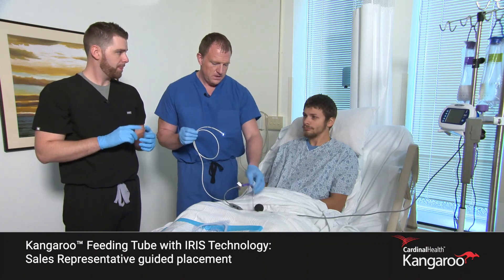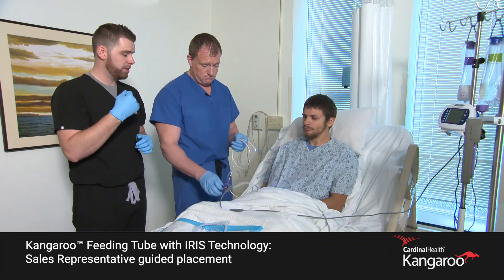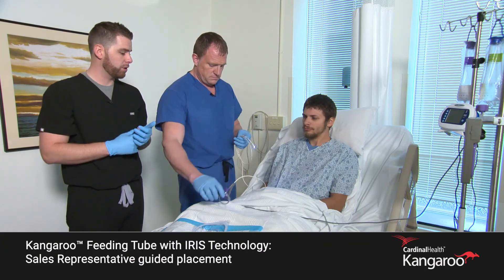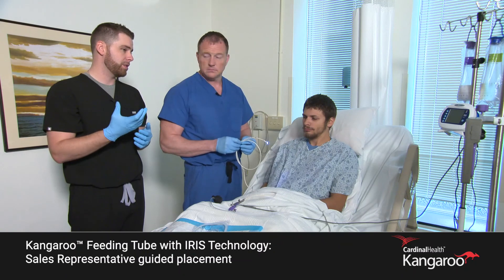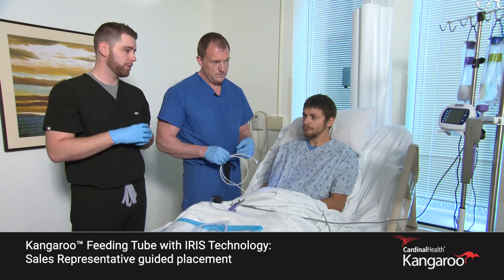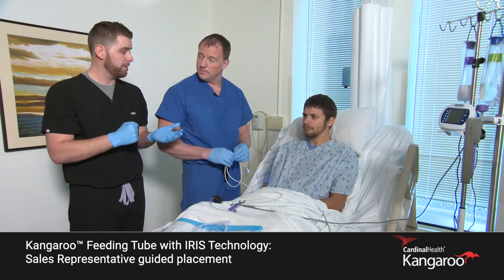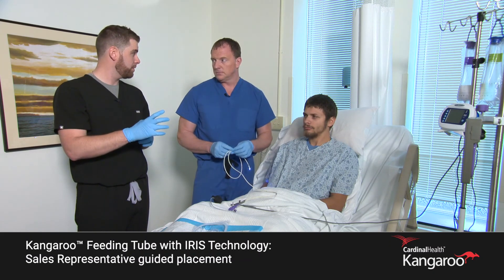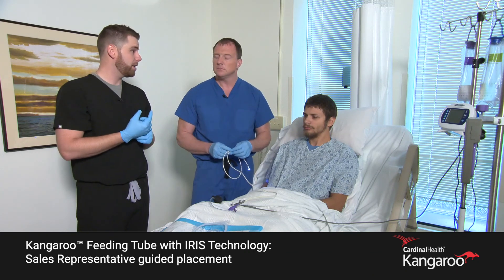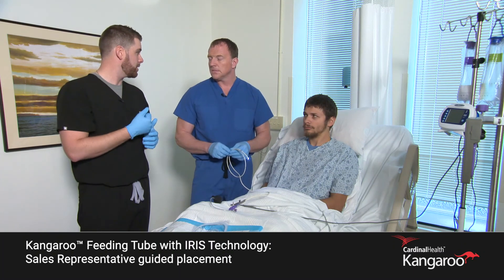Key points to remember: 30 centimeters, 50 centimeters, and 70 centimeters. We'll advance the feeding tube to 30 centimeters, at which point we'll slow down and assess the imaging. We want to see smooth, collapsed tissue — that would be the esophagus. If instead we see a rigid opening with cartilaginous rings, that is the trachea, and we will retract the feeding tube and readvance to try to enter the esophagus.